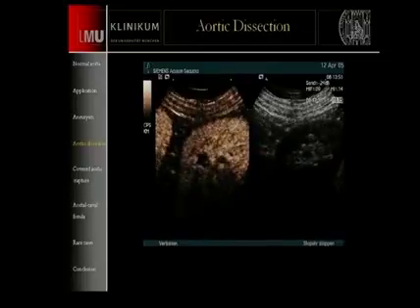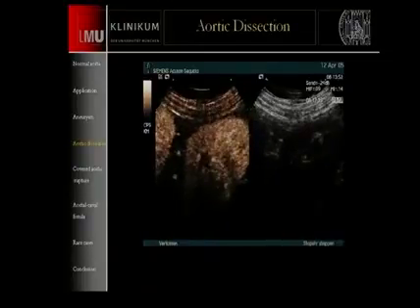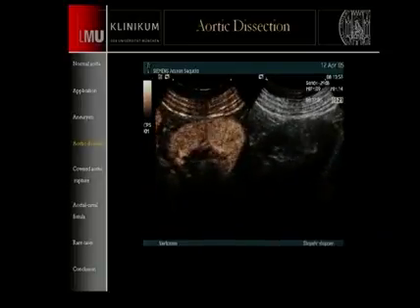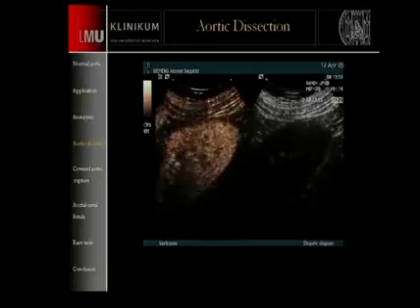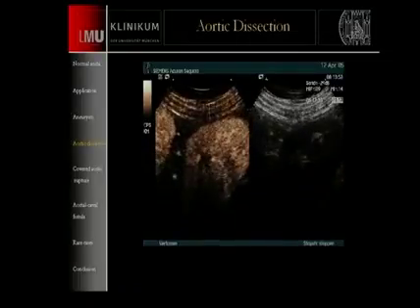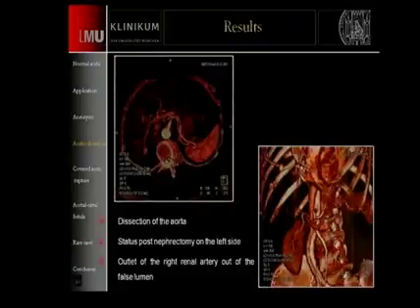Next step, I look at the perfusion of the kidney and compare it to part of the liver. The perfusion of the kidney is nice, no infarction. And if you compare from the complete side of this kidney, all over nice perfusion. So the question is why we only find the right renal artery, because this patient has got only one kidney.